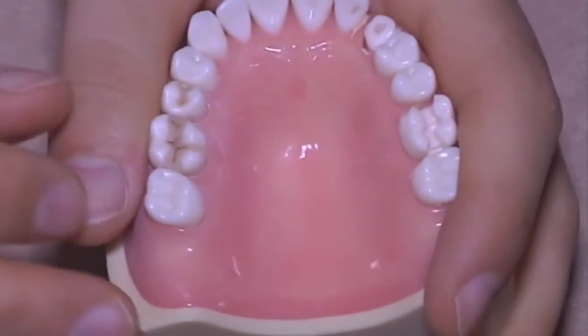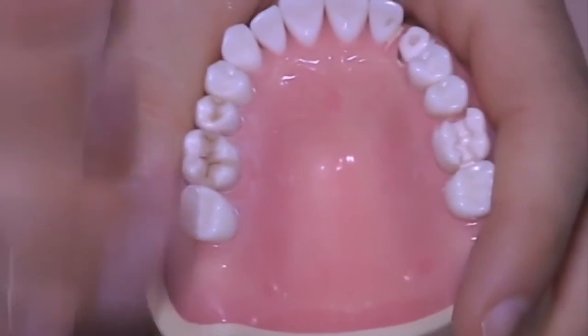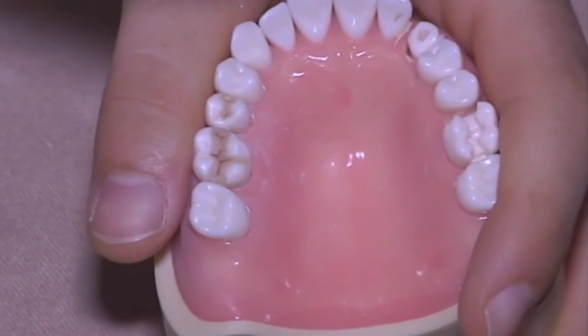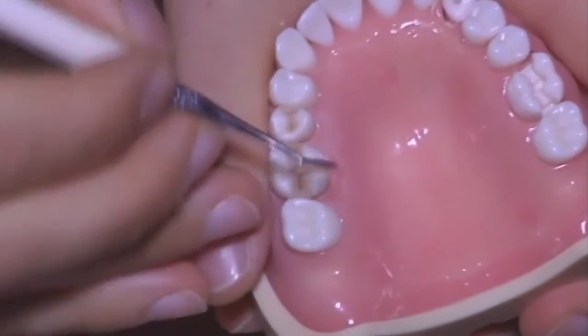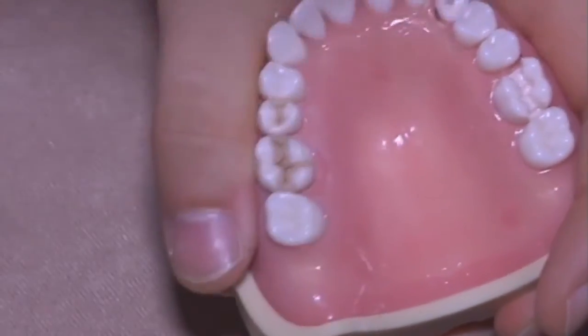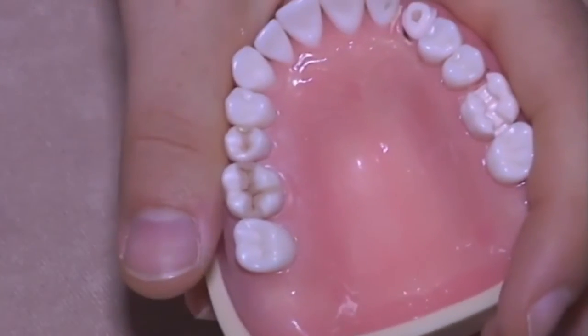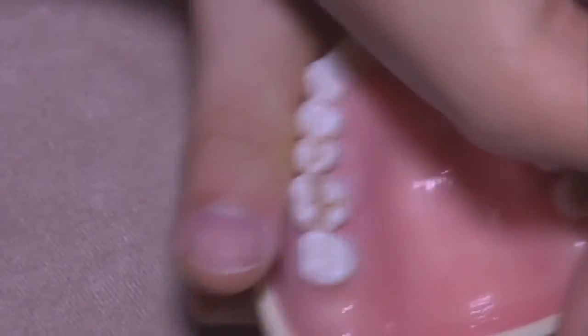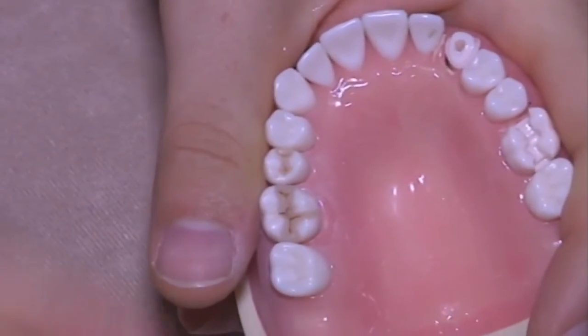And if you still have to say, no, I do not bite perfectly, and then check, you probably pay attention the first time, and the second time you pass the bur inside the composite and you disrupt everything because you don't carry it anymore. You spend 1 hour working and you will ruin that work in 1 second.